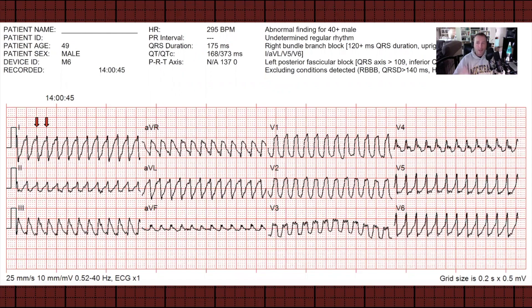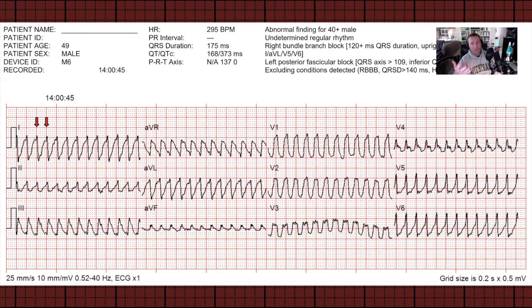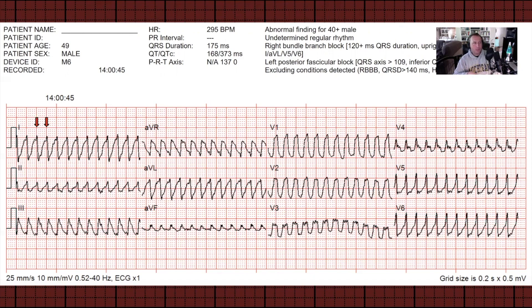That is how we use the large block method for heart rate determination. This is super helpful because if we have more than five large blocks in between R waves for a regular rhythm, we know we're dealing with bradycardia. Whereas if the R-to-R interval is tighter than three blocks, we know we're dealing with a tachycardia. And this isn't just a parlor trick — there are actual situations where getting into this habit of thinking about the large block method could be potentially life-saving.